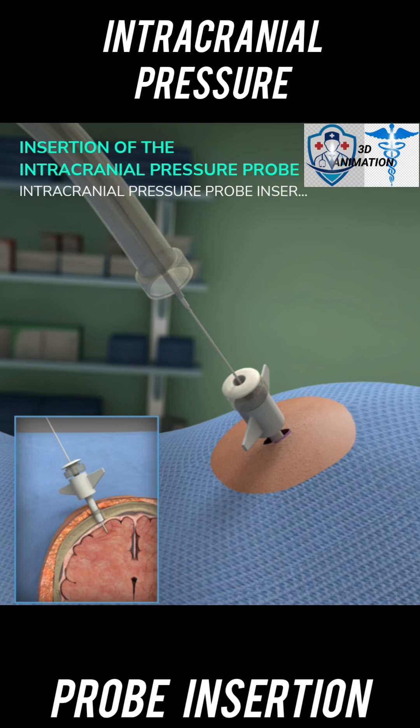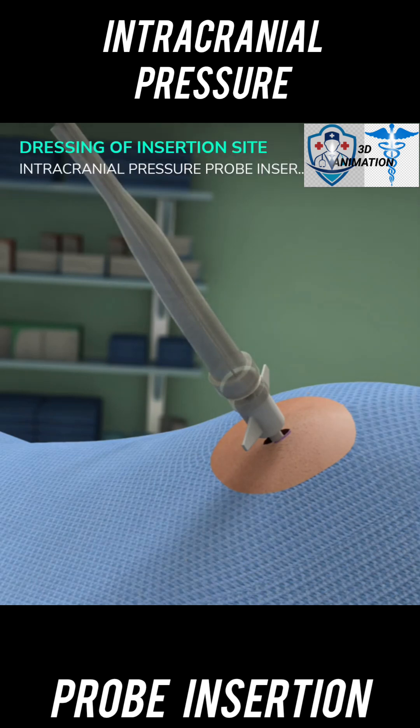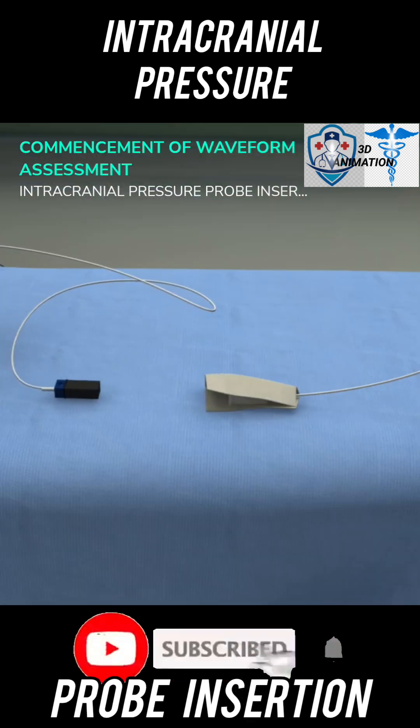Turn the compression cap found on the bolt clockwise to secure the probe into place. Slide the strain relief sheath, which can be found on the tail end of the probe, down and secure it onto the compression cap. Use 4x4 gauze and tape to dress the bolt. Reconnect the probe to the preamp connector of the monitor and verify the pressure waveform.